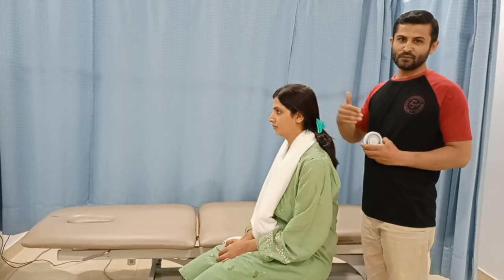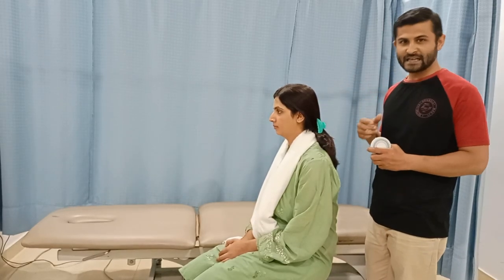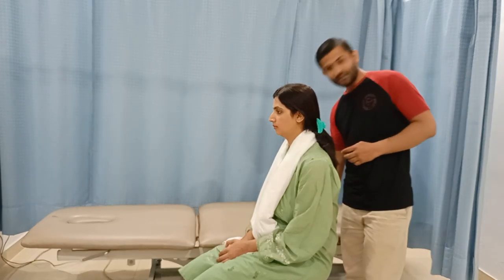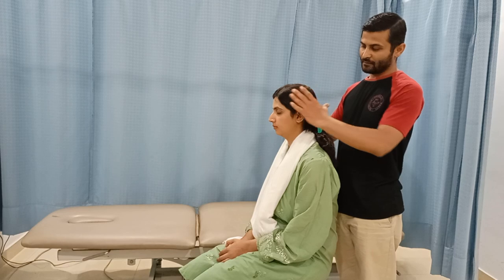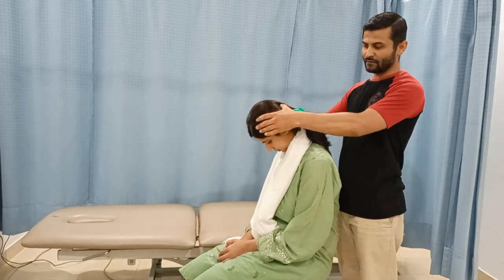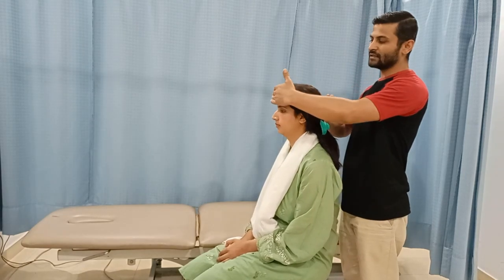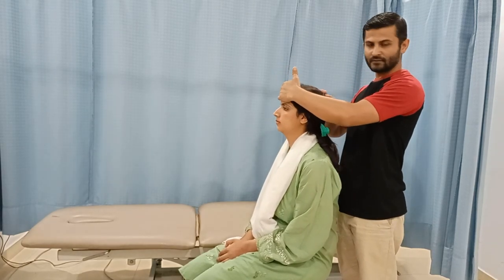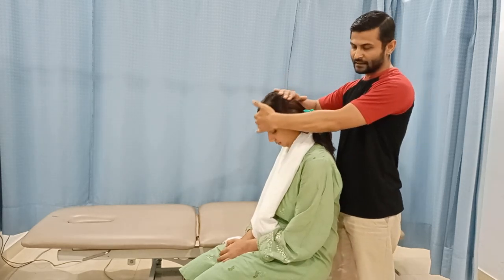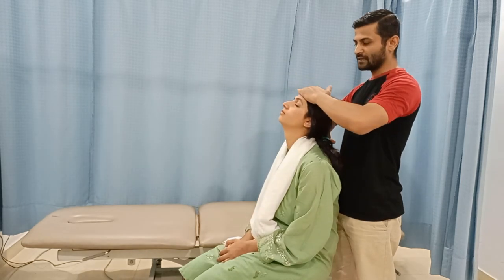Once we are done with the active range of motion, we can perform the passive range of motion as well as the inclinometry. For the passive range of motion, we place our hands and perform the flexion and extension, or place one hand in front of the patient's forehead and the other hand behind the head to perform maximum flexion and maximum extension.